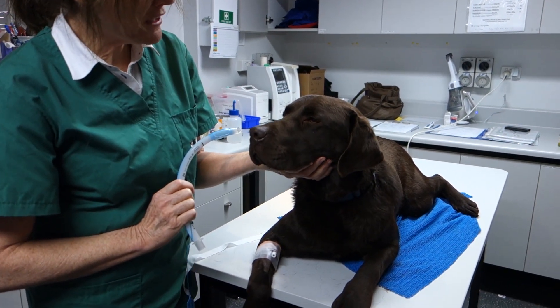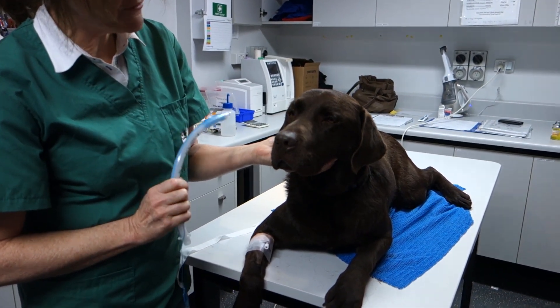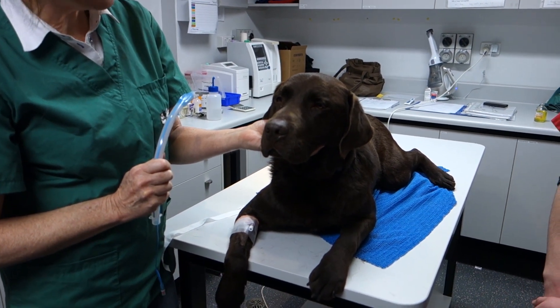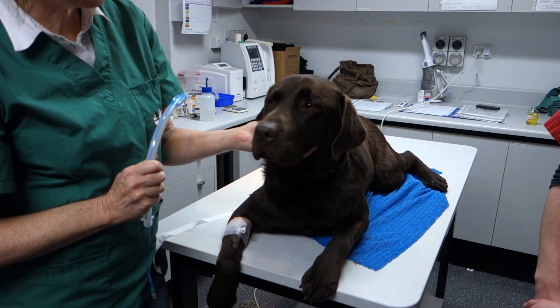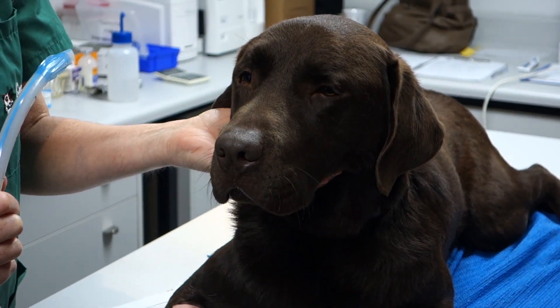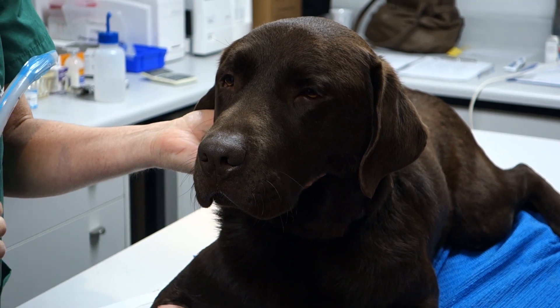The next thing we have to do is to make sure that he's anaesthetised enough to be able to pass the tube in. We need him to be in light to medium surgical anaesthesia, so we need to use our ability to judge reflexes to make sure that he's going to be deep enough to get the tube down.